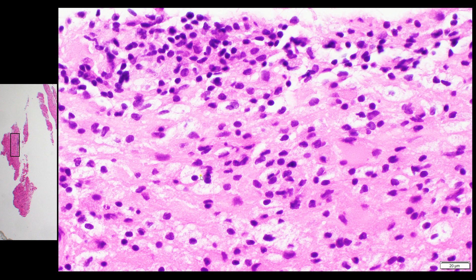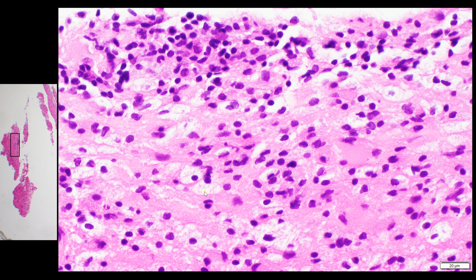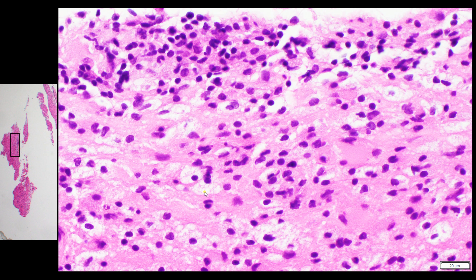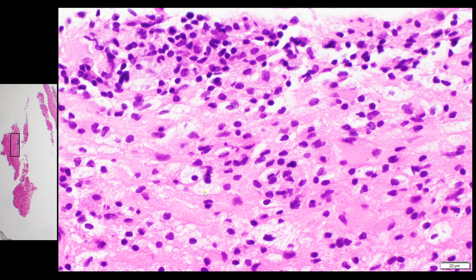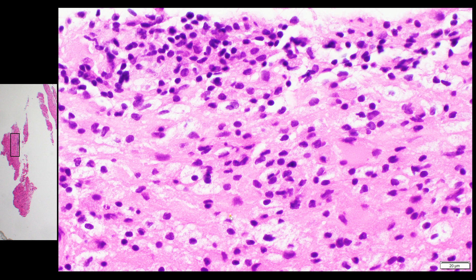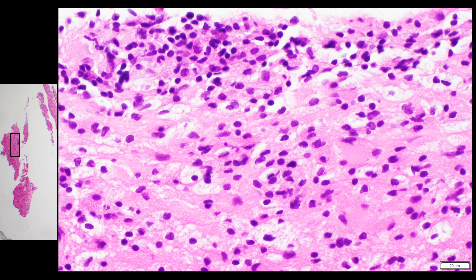This brings me to my next point. When you see a lesion that is highly rich in macrophages, you need to back away from calling it tumor. I'm going to repeat that because this is really important: if you see a lesion in the CNS and it's got a lot of macrophages in it, you have to step back from calling it tumor. Now, can you have macrophages in tumor? Certainly — anytime you have necrosis you can have macrophages — but there are a lot of other CNS lesions that also have many macrophages.